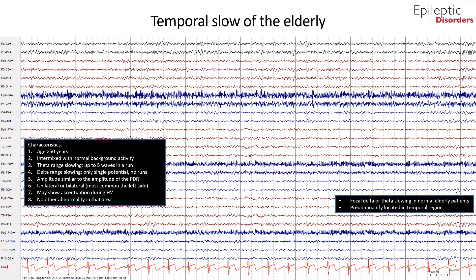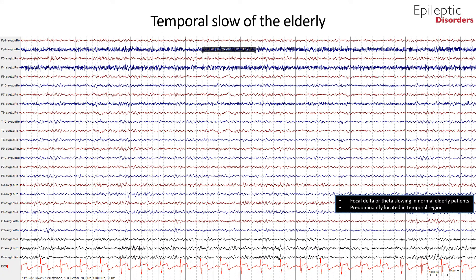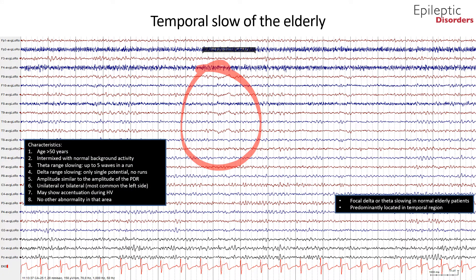In this bipolar montage EEG, you can see delta slowing over the FP1 and F7 channels; in addition, you can see focal delta slowing over the T9 and P9 channels. This is an average montage EEG showing focal delta slowing over the left anterior temporal chain, specifically noted in the F9, F7, T9, and T7 regions.